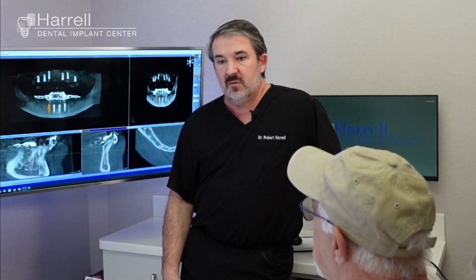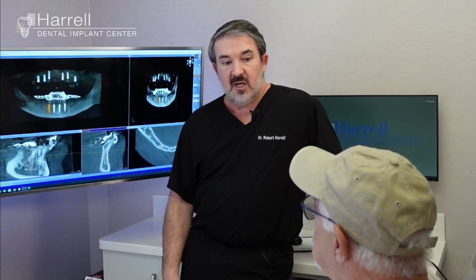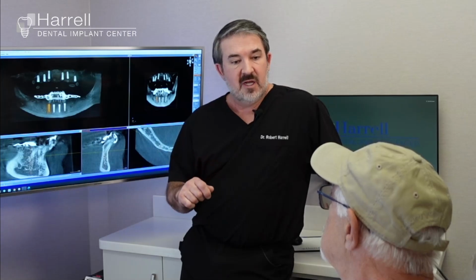Once you're finished, we usually like to have you come back twice a year for a cleaning and a check. Just like getting your teeth cleaned normally, the hygienist is going around there blowing off any debris and plaque and tartar, cleaning things up, polishing them. About once every 2 years, if we feel like we need to, we'll take them out so that we can check and make sure everything looks good underneath.